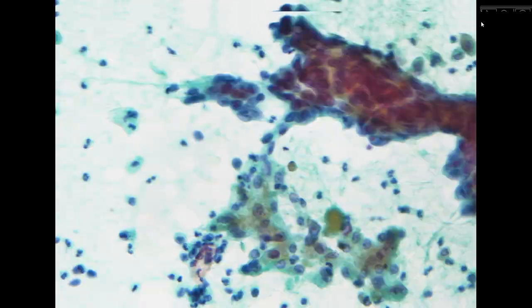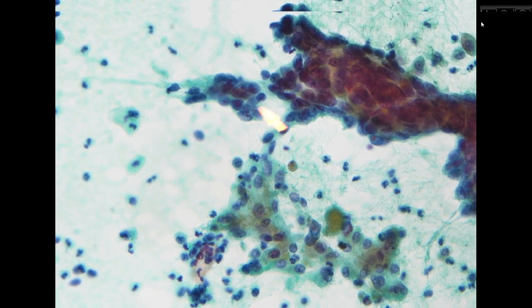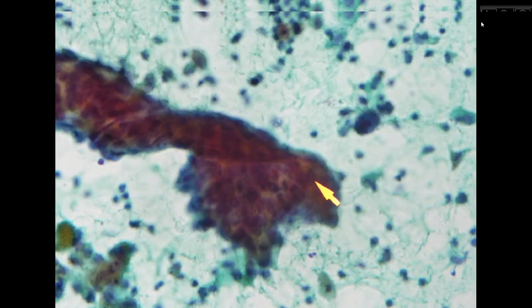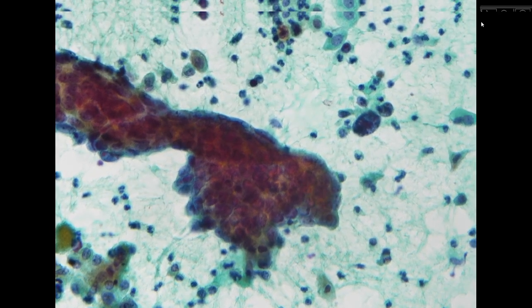It's very three-dimensional, and the nuclear atypia is very obvious. So this is consistent with adenocarcinoma, and it's consistent with the patient's past history of high-grade serous carcinoma.